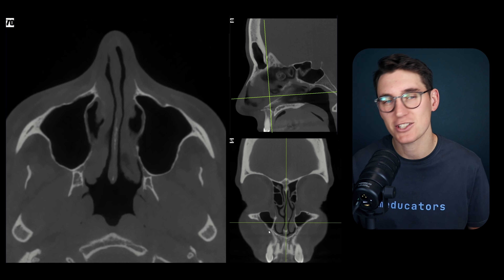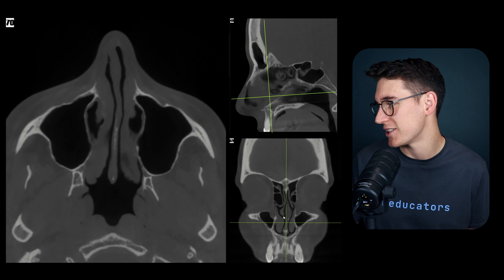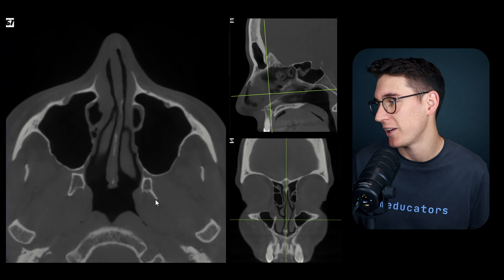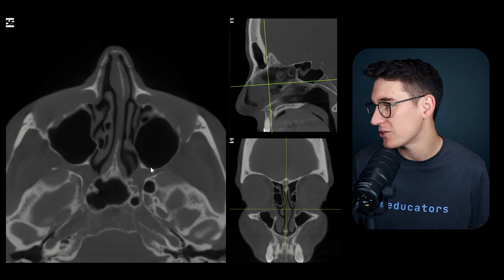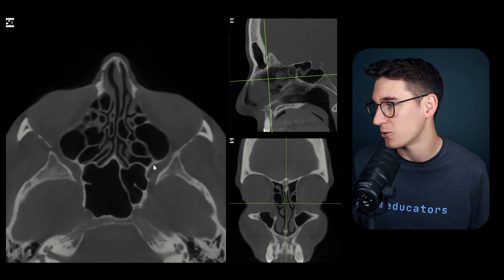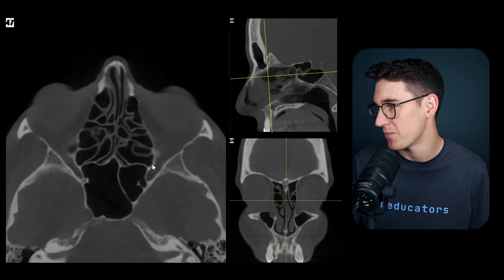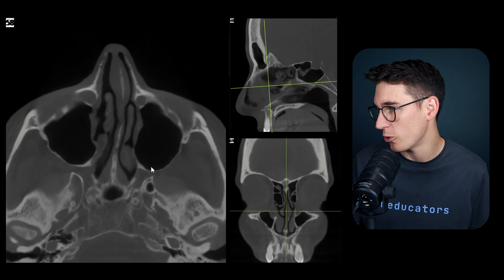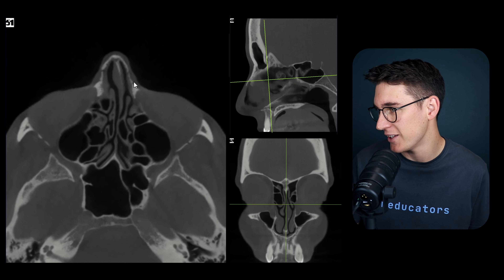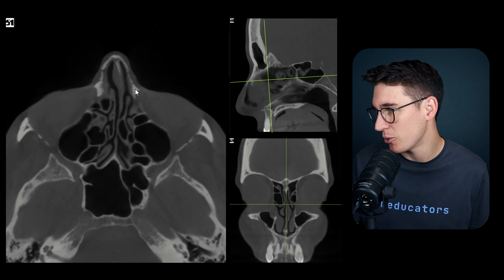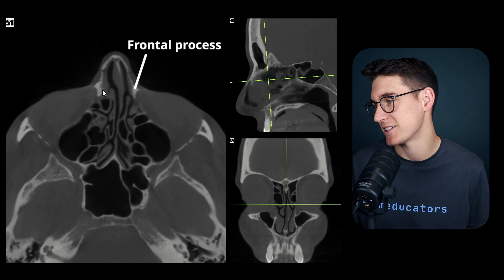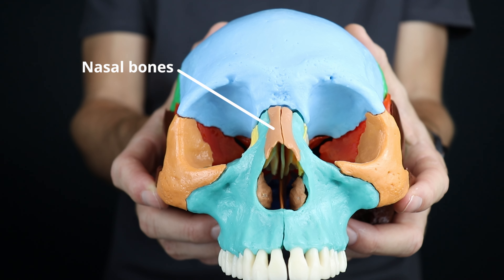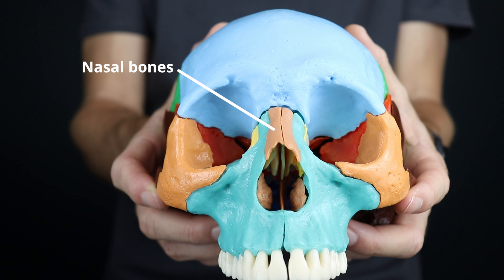Having looked at the body, let's find the processes. Going up superiorly on our axial slice from the floor of the orbit, this piece of bone here is the frontal process of the maxillary bone. Anterior to that are our nasal bones that we looked at previously.